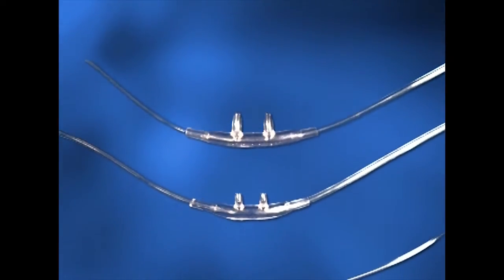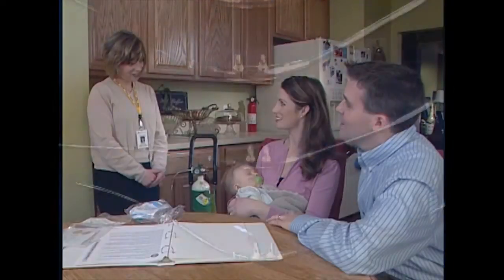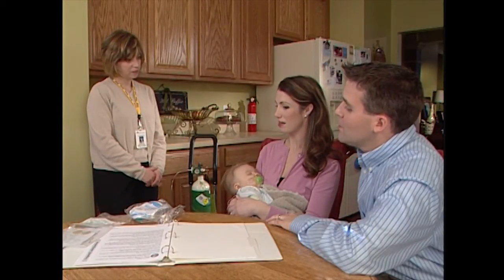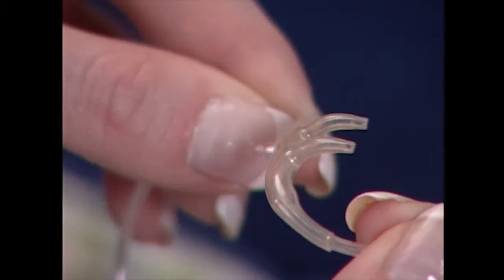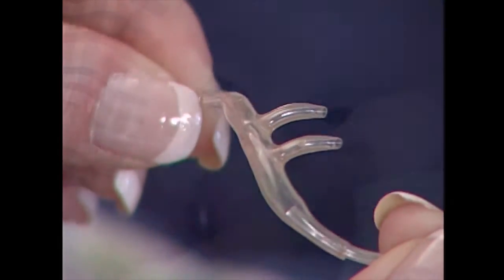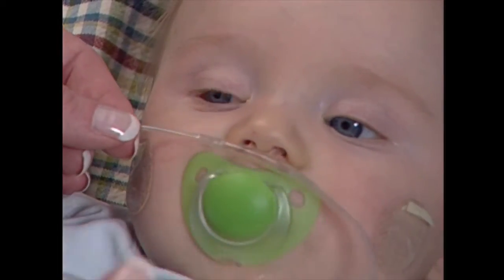Pediatric Home Service has a variety of nasal cannulas from very small to adult sizes. Your pediatric home service clinician will determine the size needed for your child. A nasal cannula allows oxygen to flow out of the curved prongs that are placed inside the nostrils of your child. When placing a cannula, make sure the prongs face downward.